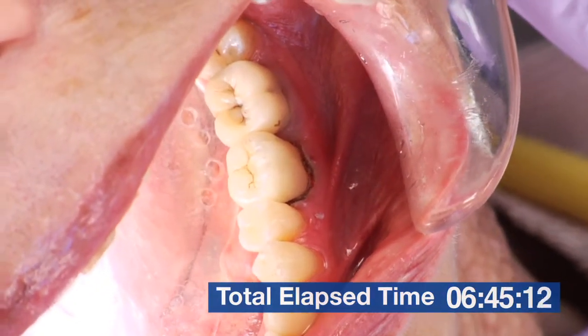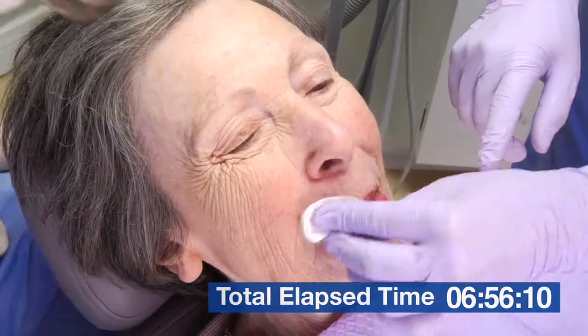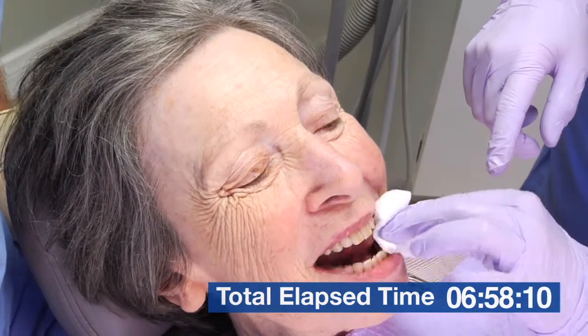The color looks good. Let's take this out. And that's the cementation in about seven minutes with Isolite.